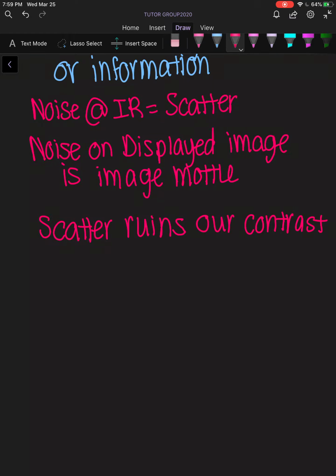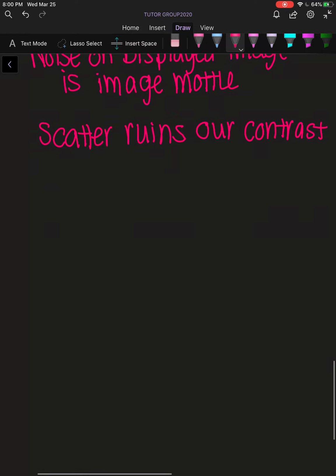Now, sometimes, they say in direct radiography that you can go up to the computer and manipulate this image. If you don't have enough of something, maybe you can add a little bit. But sometimes that doesn't always work, and that is because of imperfections in the computer reconstruction algorithms, and that is known as algorithmic noise. So when our software tries to clean up an image, it doesn't always work, because of the algorithmic noise.